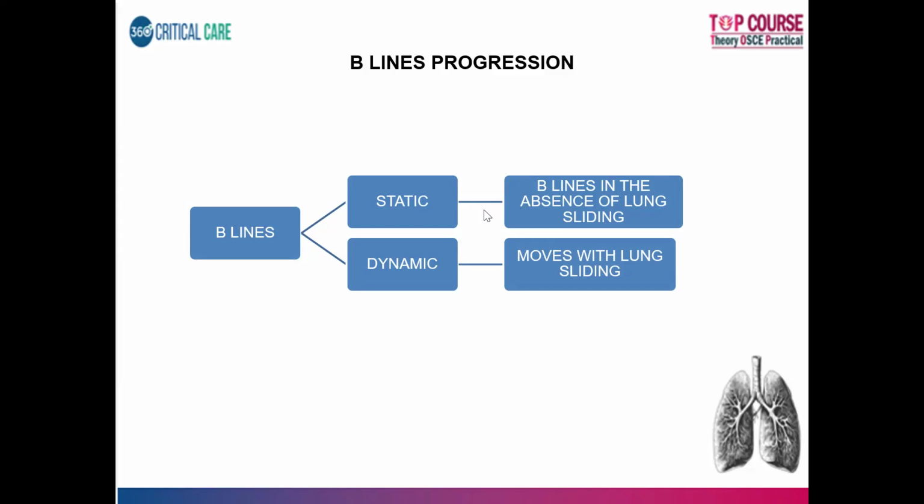Or else, if the patient is developing pulmonary edema when you're giving fluid resuscitation and you're assessing the patient for volume responsiveness, in all these cases you look at dynamic B lines. So why does this become important? Because there are certain nomenclatures which they have mentioned.